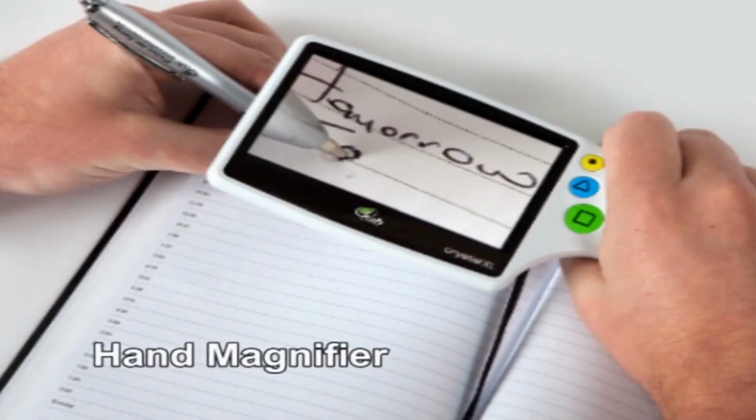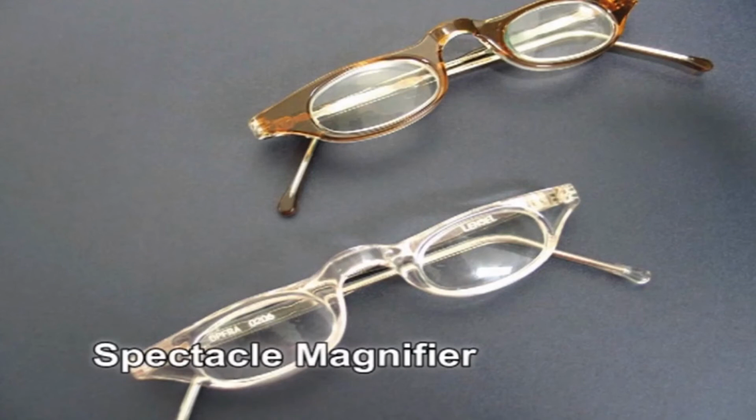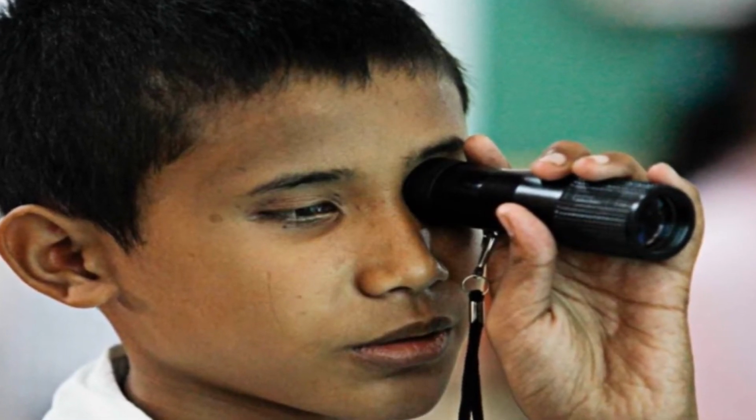Near vision optical devices consist of hand magnifier, stand magnifier, and spectacle magnifier. Telescope helps to improve distant vision for persons with low vision. We will now see the optical devices that help in near vision and also how to use them. The optical devices, near vision. The first device that we are going to see now is the hand magnifier.